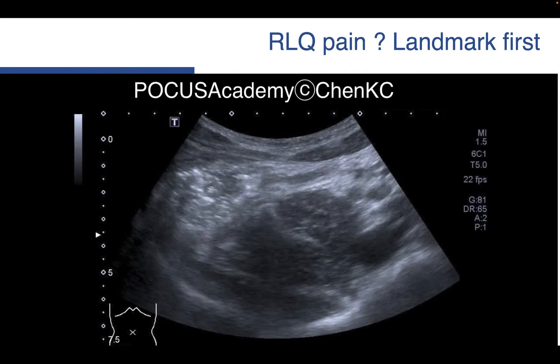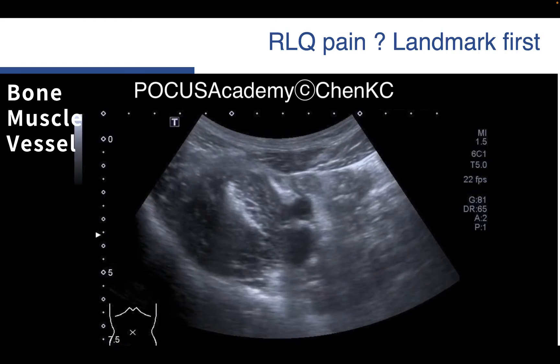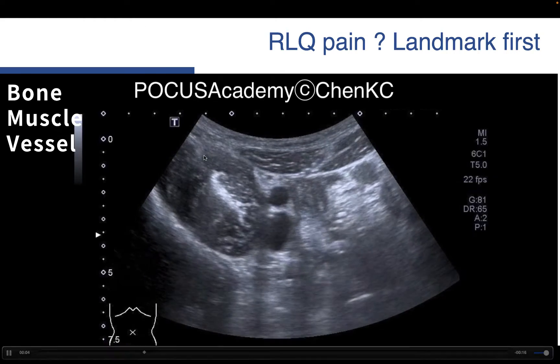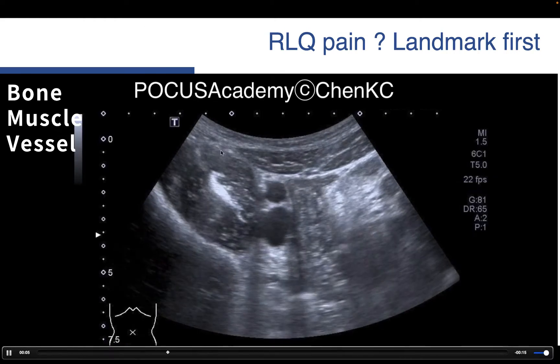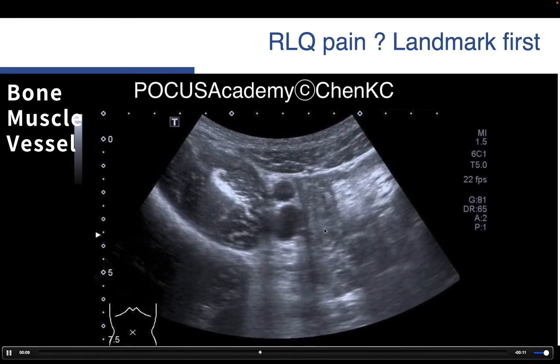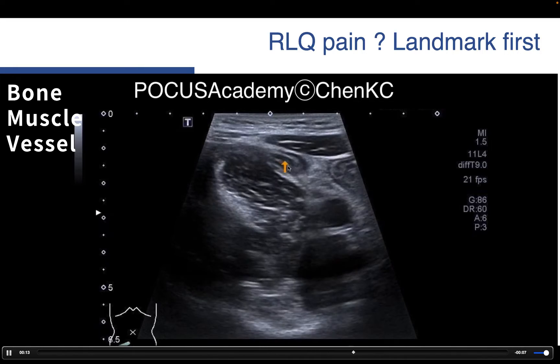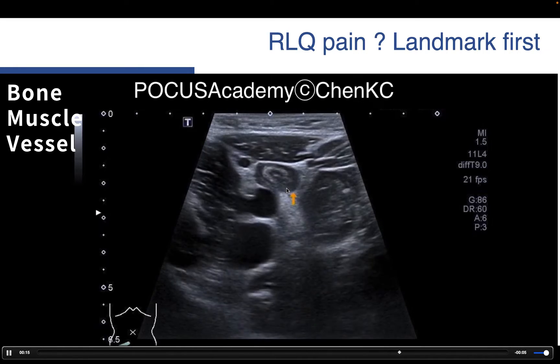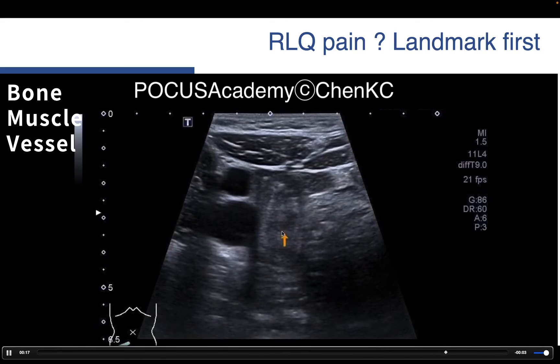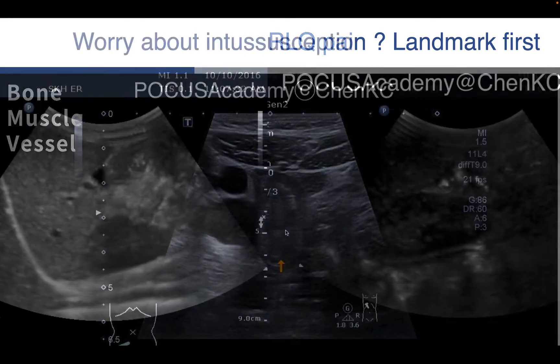When you encounter patients having right lower abdominal pain, I recommend to scan the landmark first. Recognize what landmark? The iliac bone, iliac psoas muscle, and iliac vessels, and scan around these regions. We can see these structures, and then shift to a linear transducer. We can see this distended appendix just lying immediately to the iliac vessels. It is appendicitis.